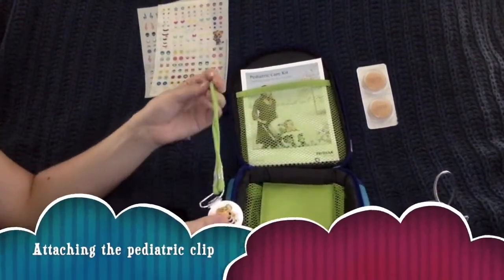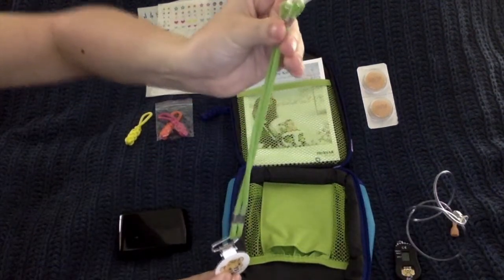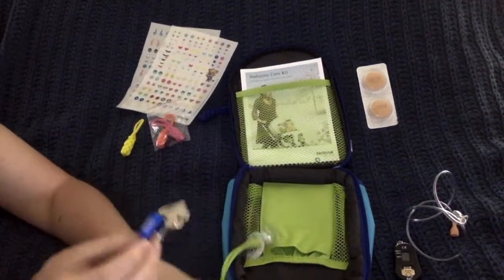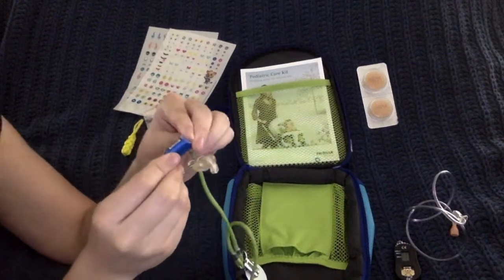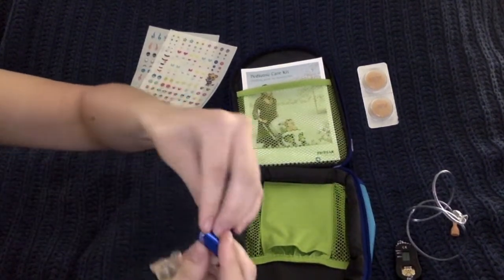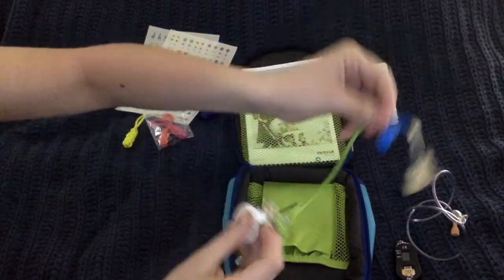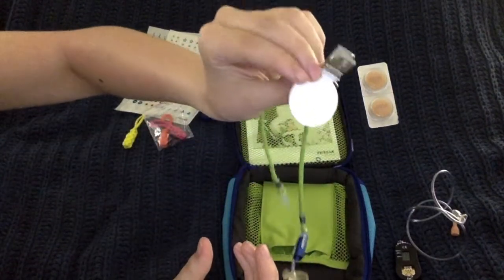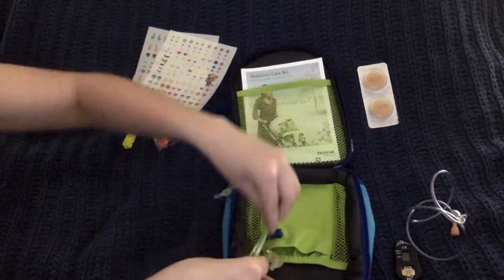The Pediatric clip has 2 silicone rings that are used to slide onto the hearing aid. So we have our hearing aid. We take the silicone rings and we just slide it up the hearing aid, like so. And then we have our little clip that we can put on the back of the kiddo's t-shirt and clip right on. The clip is great for babies or kiddos who are more active, so we don't have to worry.